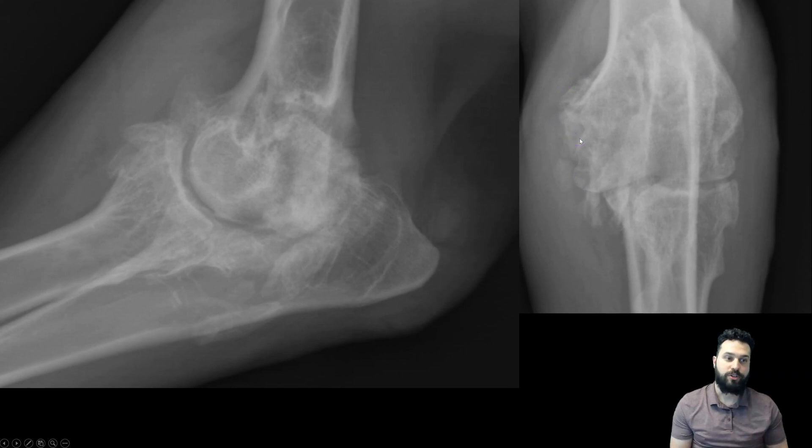So this is a lot of periarticular bone proliferation. When we're looking at a joint like this that is so significantly affected, we need to ask ourselves: is this aggressive or not? In this instance, this is not aggressive. The things I'm looking for to tell whether a joint is aggressive include any evidence of bone lysis, especially at the level of a joint, and joint-associated tumors. I don't see any evidence of lysis, so we can conclude this is a degenerative joint.